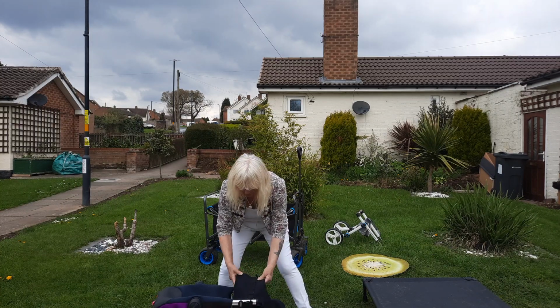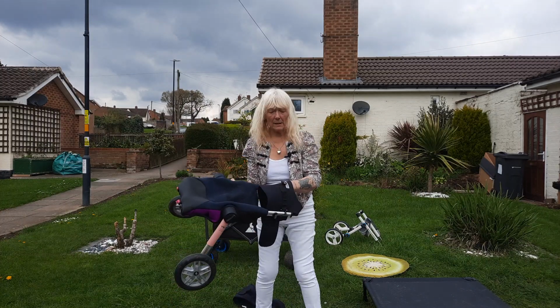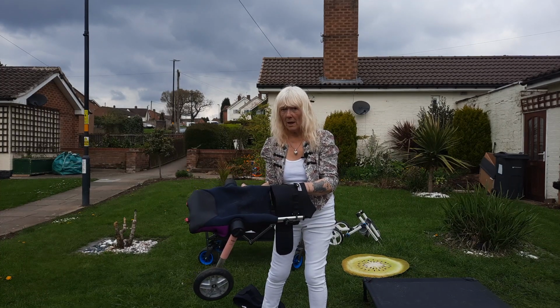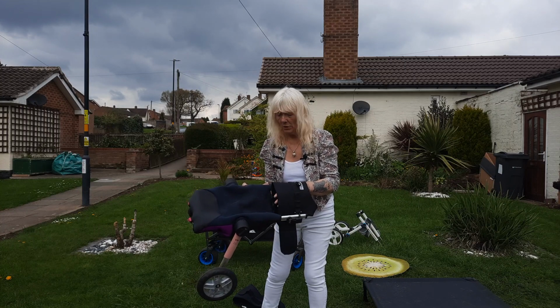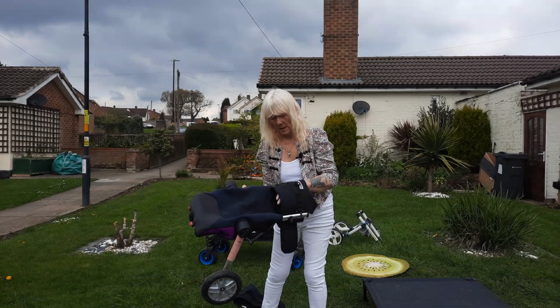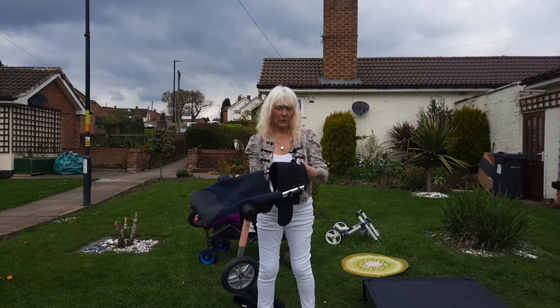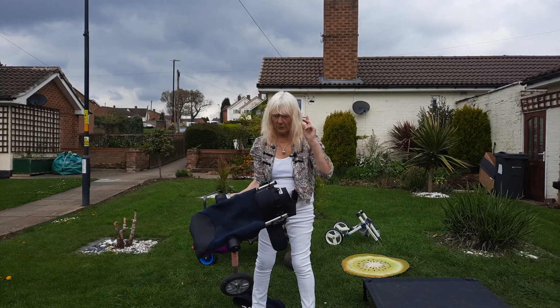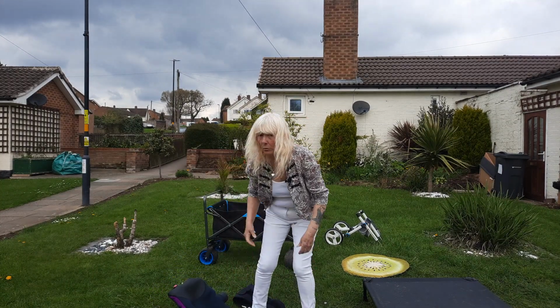As you can see from that, how close that is to what we've made her, the double amputee hammock, I call it. There's no gaps in between. So she sits in there. We do put a vet bed on that as well. So there's no gap. She cannot possibly come out of this. I think it's great for comfort and safety. So as I say, I'm always trying to think of things to improve her equipment for her.